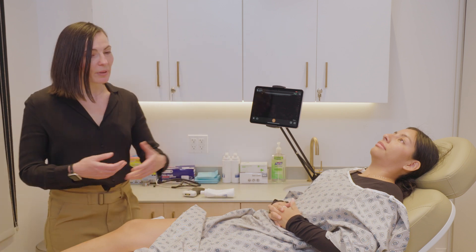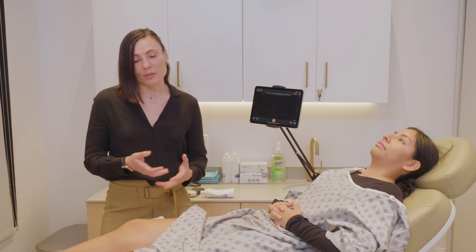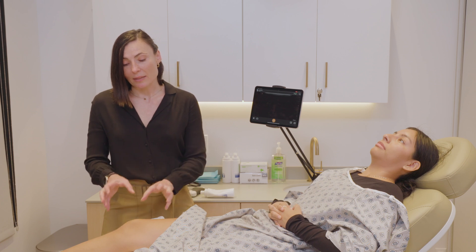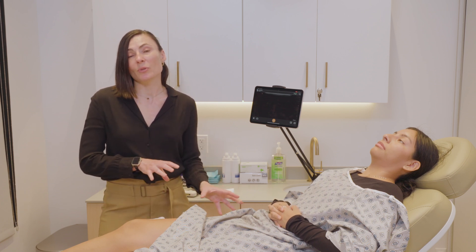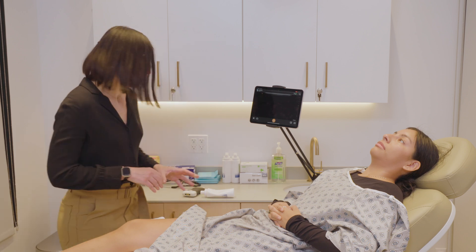Typically you want your patient to be positioned supine, but the knee is slightly bent. You can put a roll underneath the knee, or you can also do it with the patient sitting down.